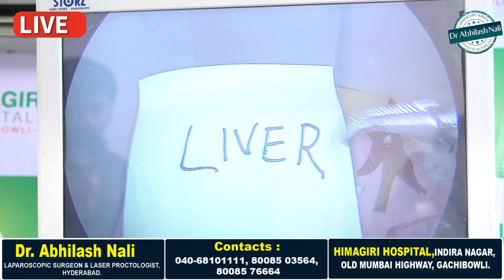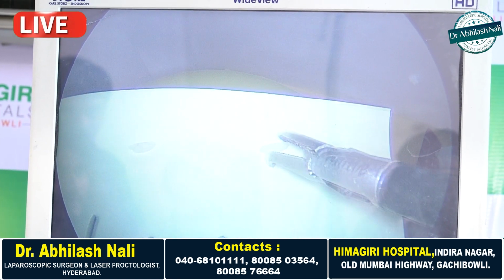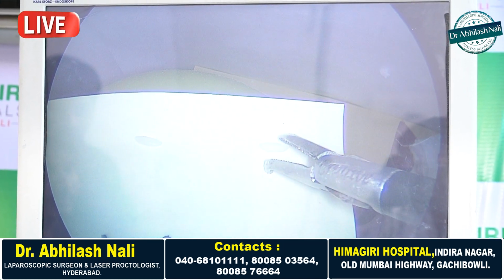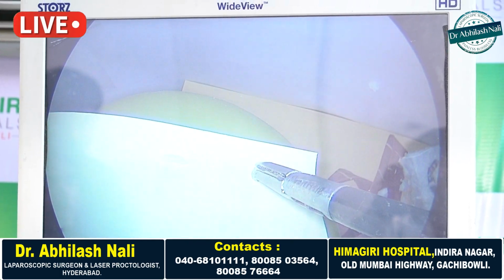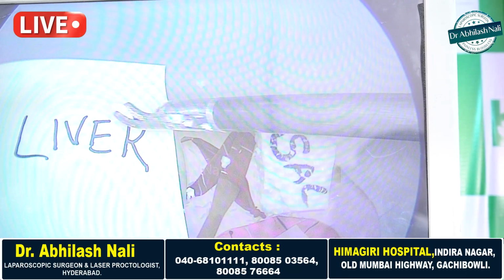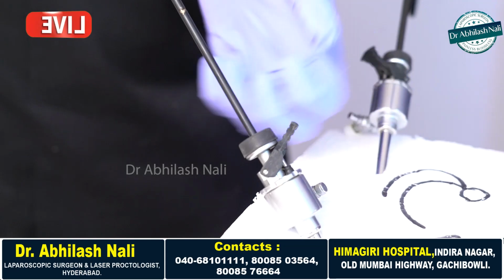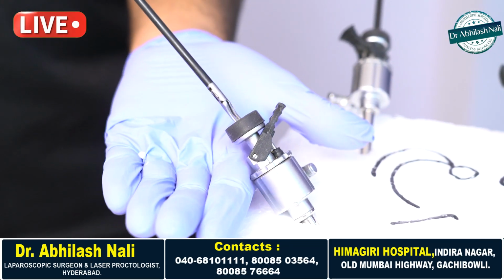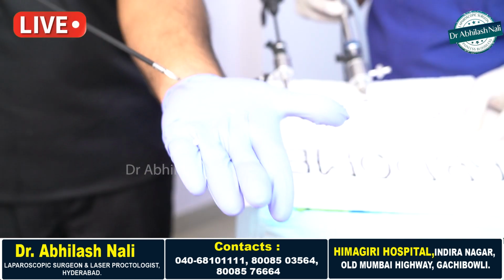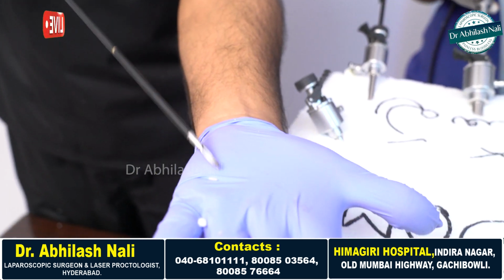For example, if we have to remove a small stone inside, through this camera and these laparoscopy instruments, we will be able to catch the stone. Through laparoscopy, we can catch small stones and remove them from inside. Now you can compare the advantages of laparoscopy over open surgery. So this is the stone removed.